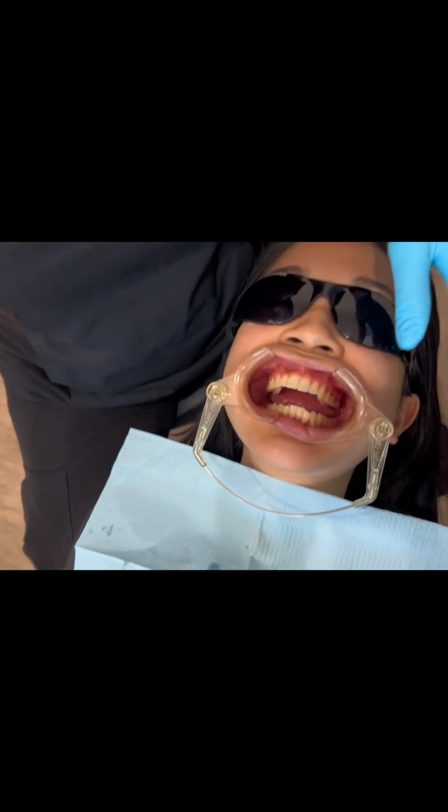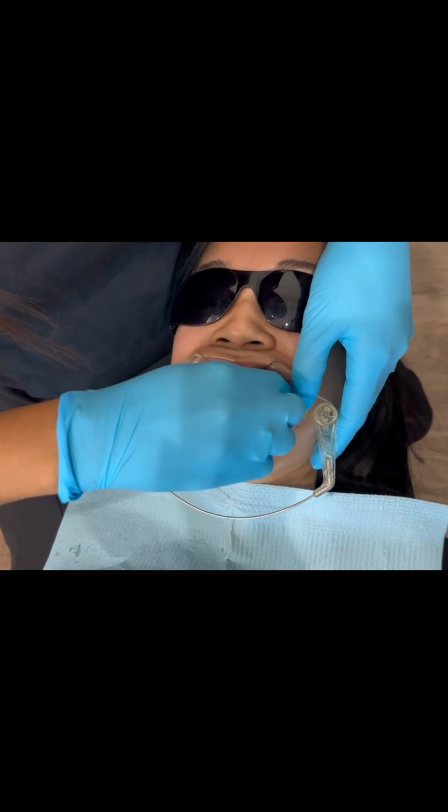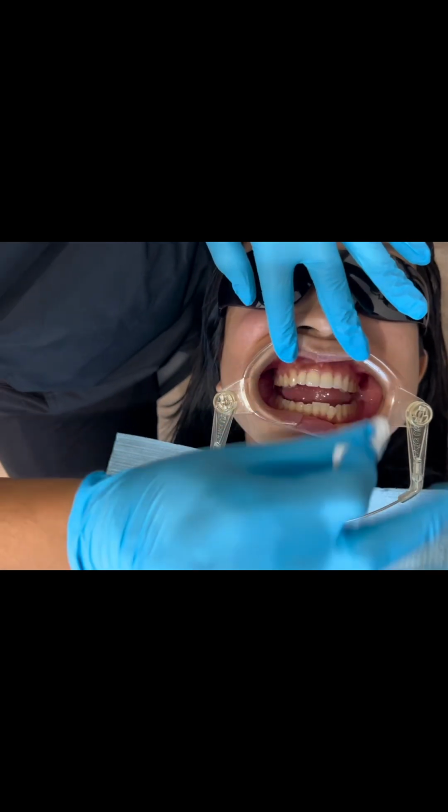Anyways, so now I get a cotton roll again, another cotton roll. And notice I'm taking from the same, and I'm going in order of my setup. I'm gonna take the cotton roll again. Now usually, I'm just drying the teeth.